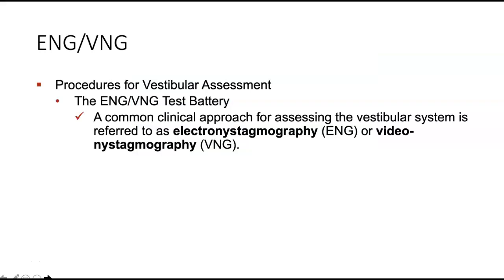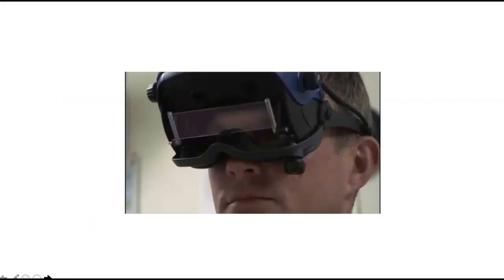The test battery, most common is VNG, video nystagmography. Basically, people wear these goggles. This device here monitors eye movement, and there's times where the goggles are open, and times where the goggles are closed. This little blue piece slides down to take away their vision.